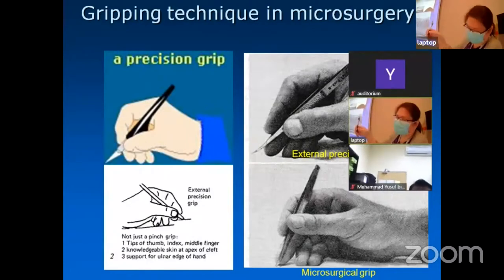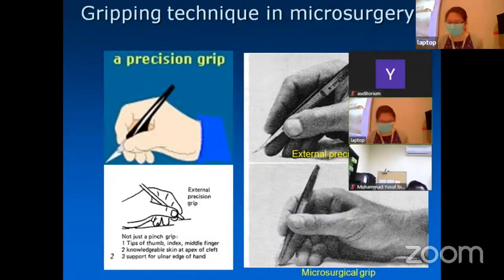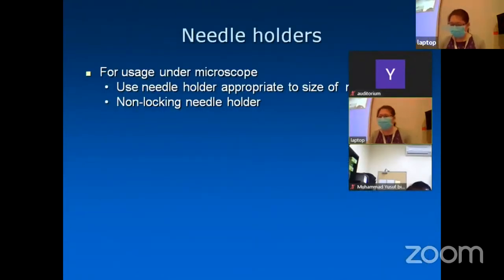In this position as well, instead of being in the sagittal plane, the instrument is actually at the paracoronal plane. Okay. This is the microsurgical grip. So after we know about the precision grip, let's proceed. What are the instruments that we use in doing our microsurgeries in ophthalmology? First of all, your needle holders. The needle holder should be appropriate to the size of the needle.